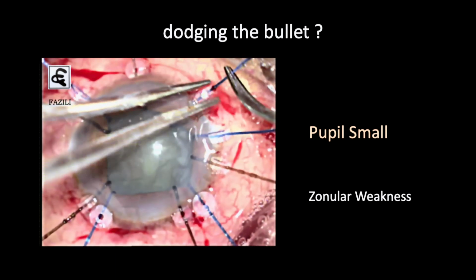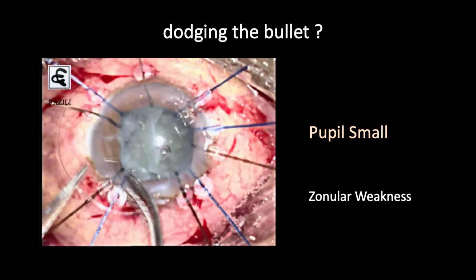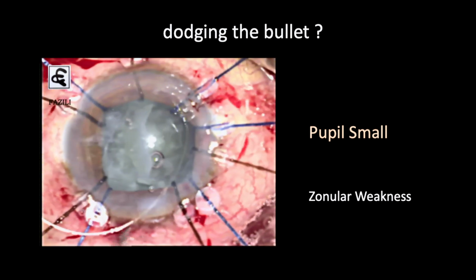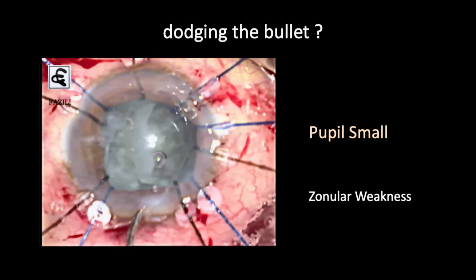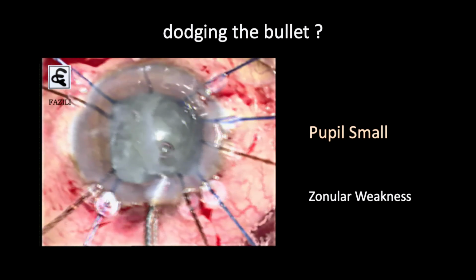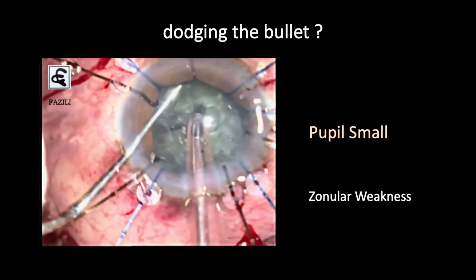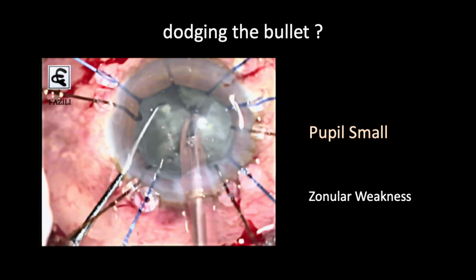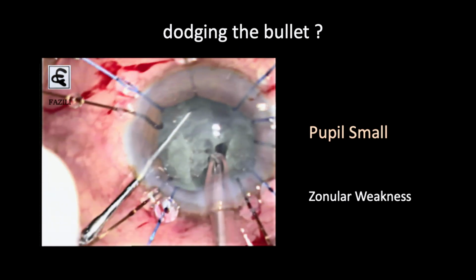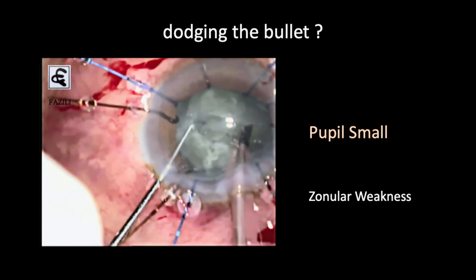Here again, CTR is an important thing for stability during the surgery. Here I'm placing it before the nucleotomy. So it is giving us additional equatorial support. You can see this CTR is going in before the nucleotomy. The nucleotomy will not become difficult, but finally the IA becomes difficult because the capsular tags and the cortical matter get entangled in the CTR, and it has to be removed tangentially.